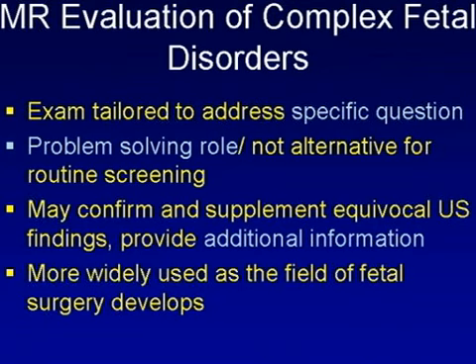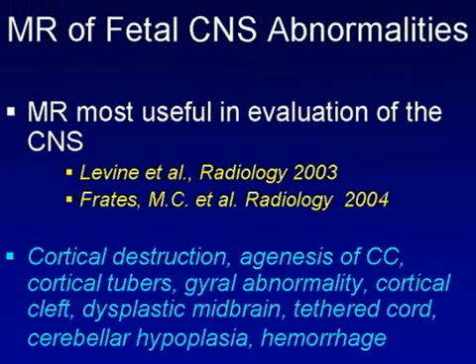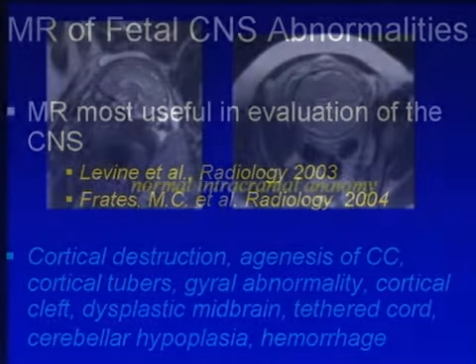This is not used as a screening test. The exam is tailored to address a specific question, and it can be used as a problem-solving tool. It may also supply additional information if there are unanswered questions at sonography that may impact on how the pregnancy is managed and how the patient is counseled. It's been shown in several studies that MR is very helpful, particularly for looking at fetal CNS abnormalities.